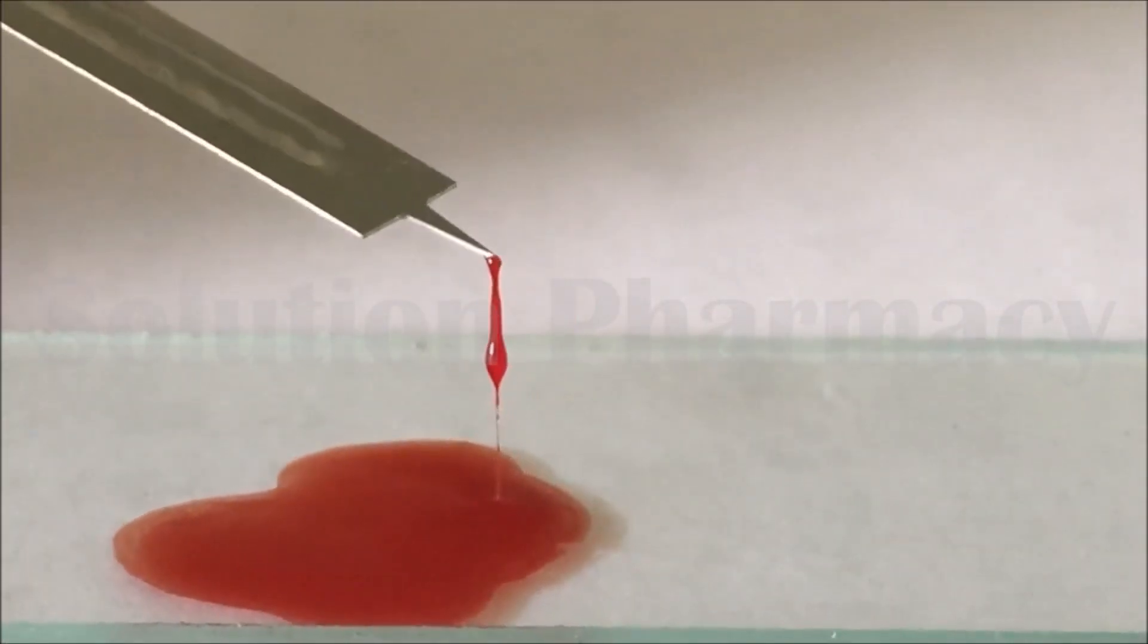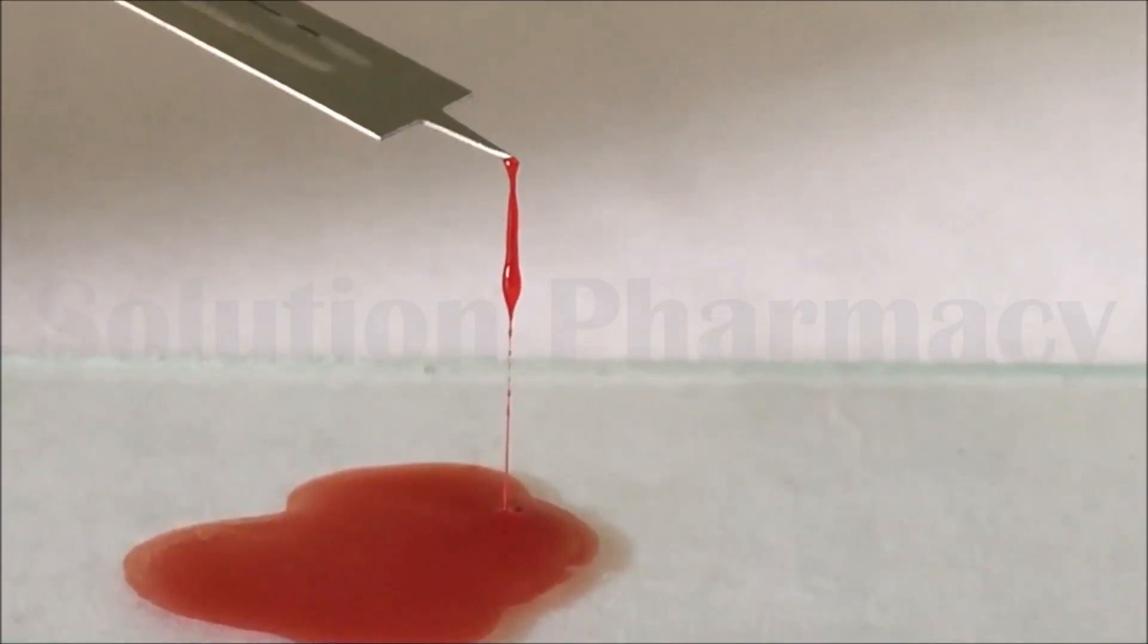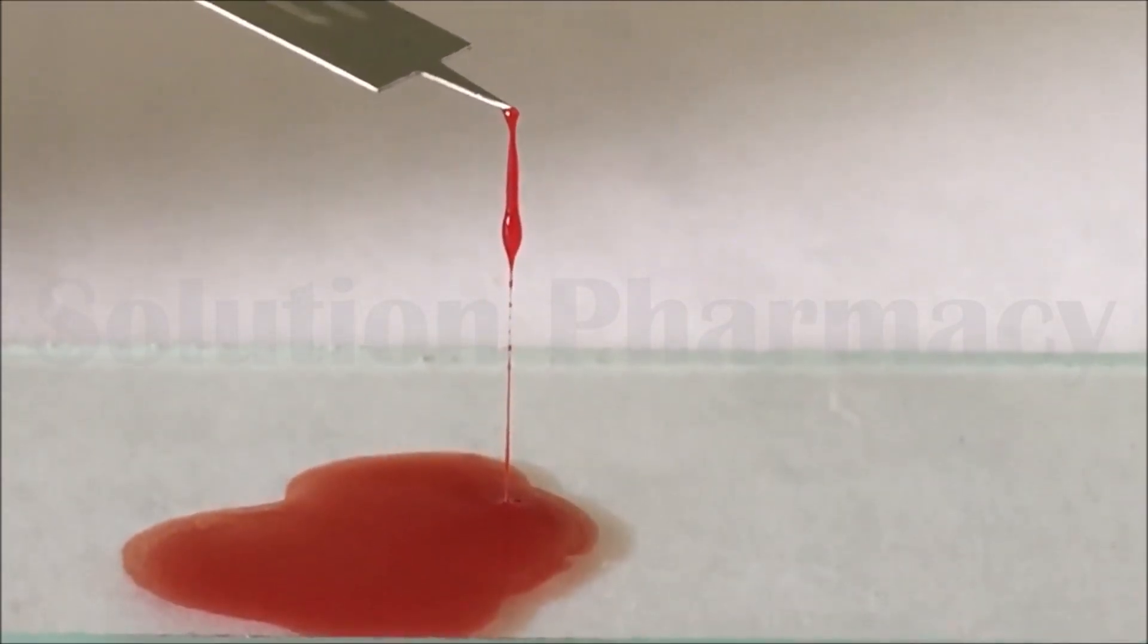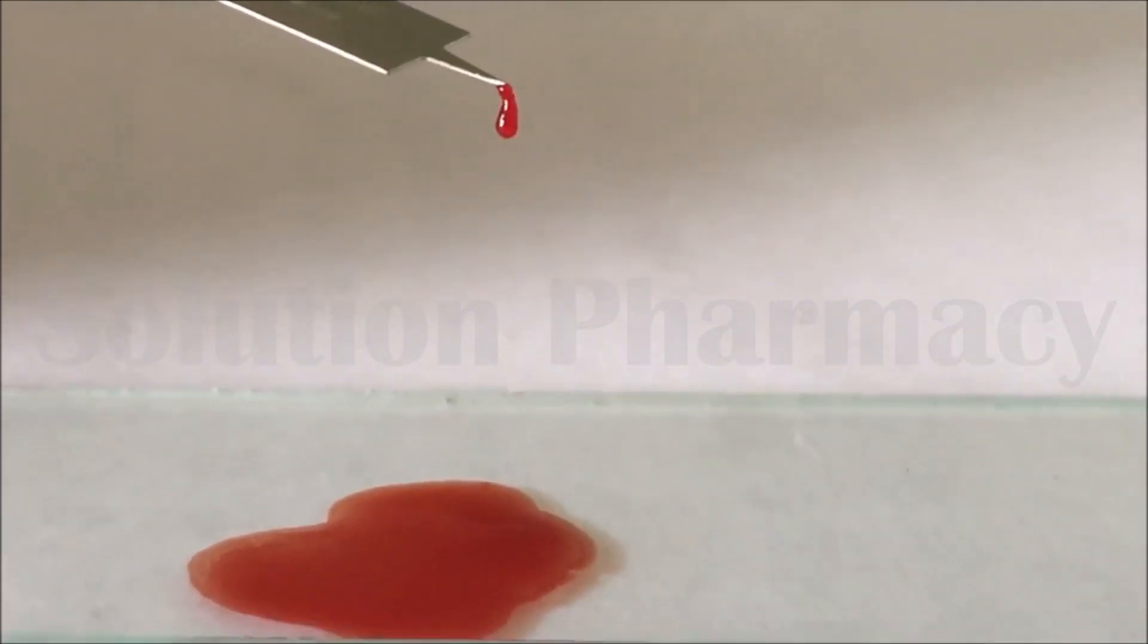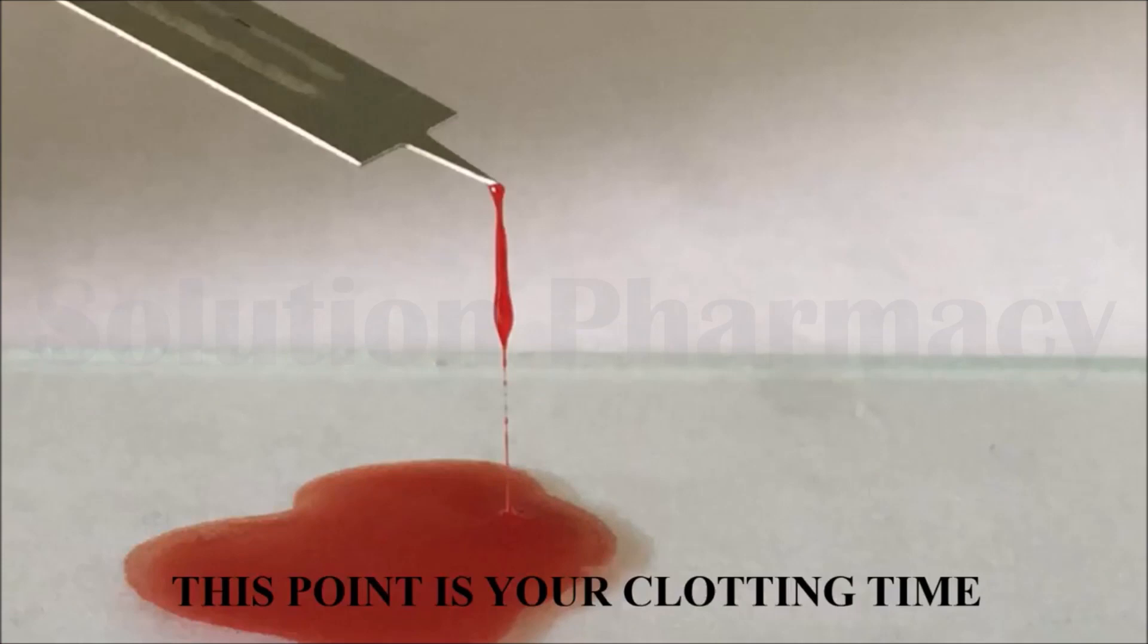Note the time. This time is called the clotting time of our blood sample, determined by the slide method. Clotting time is the time at which clot formation takes place, or the time required for a blood sample to coagulate, which is the time interval between the appearance of blood on the finger to the formation of thin fibrin thread.